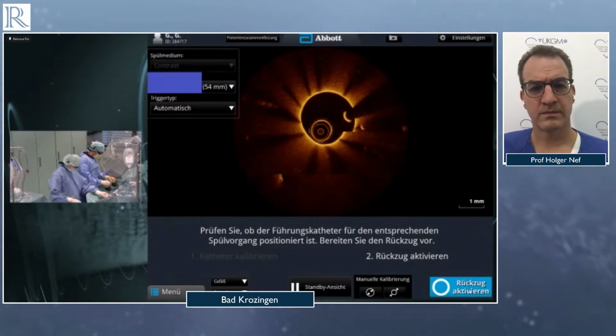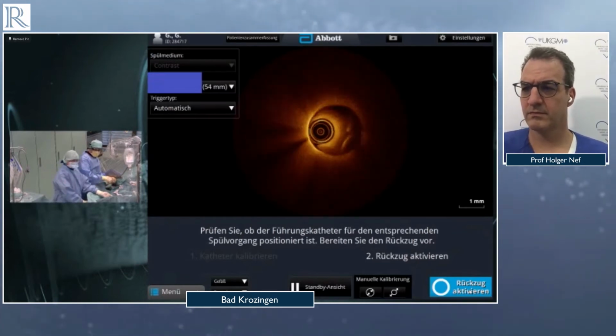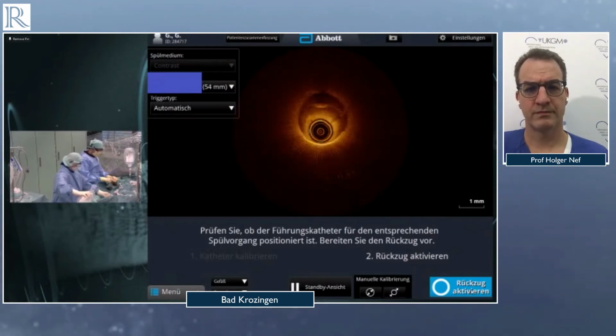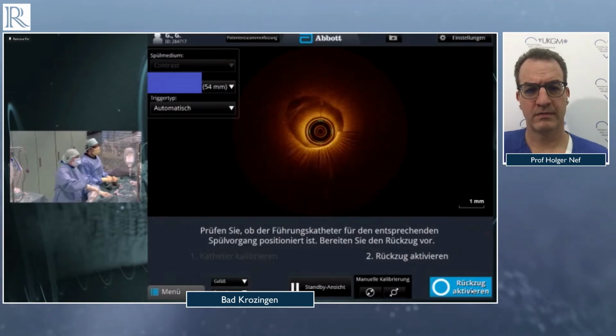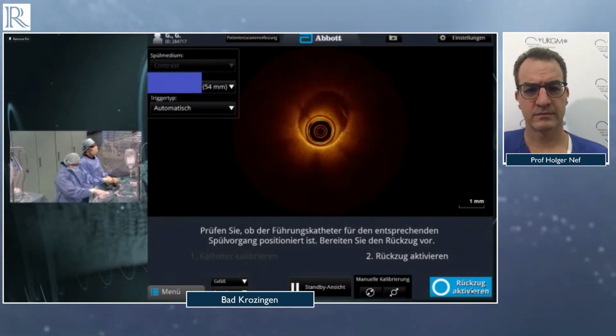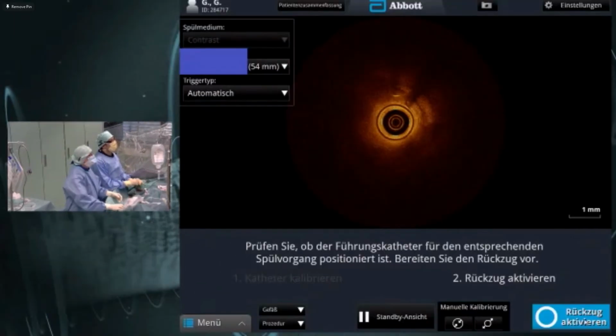Well, this was Axiom coil. It was due to distal rotablator perforation because I had to go a very long way down with the Dynaglide in the lesion already, to get the distal part rotablated, and unfortunately got lost in a side branch with a wire. So Axiom from EV3. And I mean, it's not a big deal to implant them, and it's a very big safety aspect.